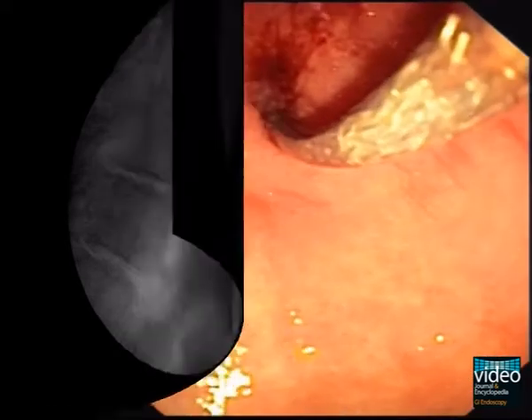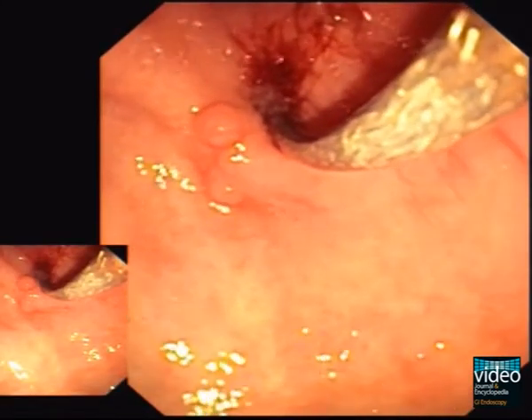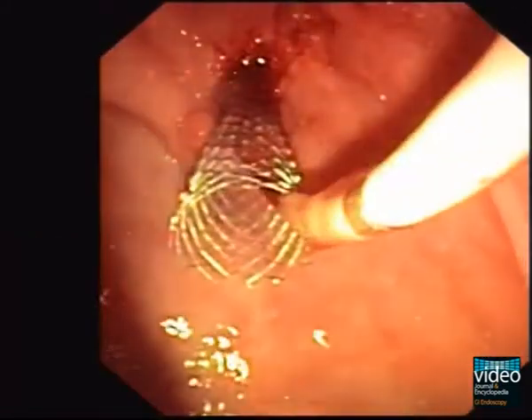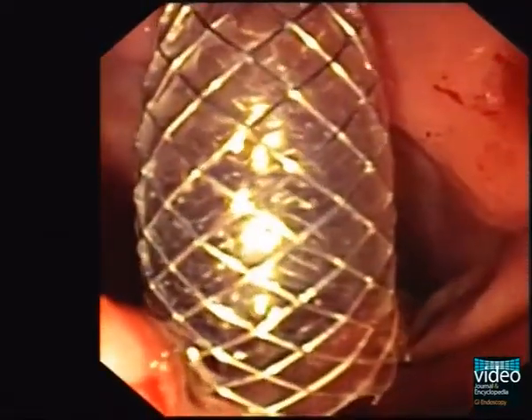The stent delivery system, armed with a fully covered metal stent, is pushed over the guidewire and watched closely using fluoroscopy. Stent delivery comprises gastroscopic control and checking the correct position of the stent using fluoroscopy.